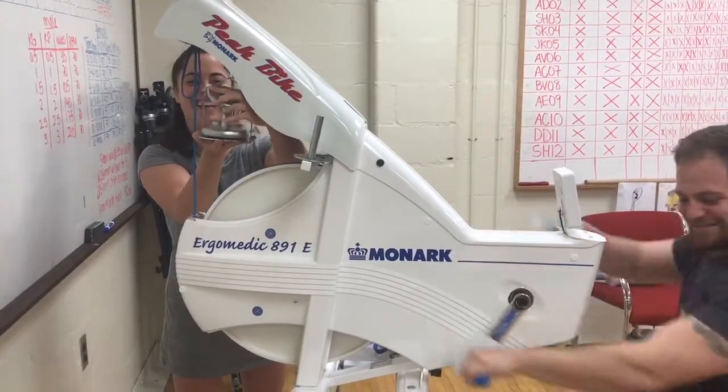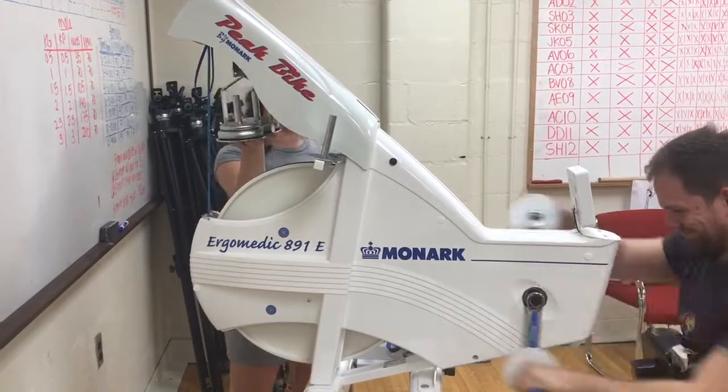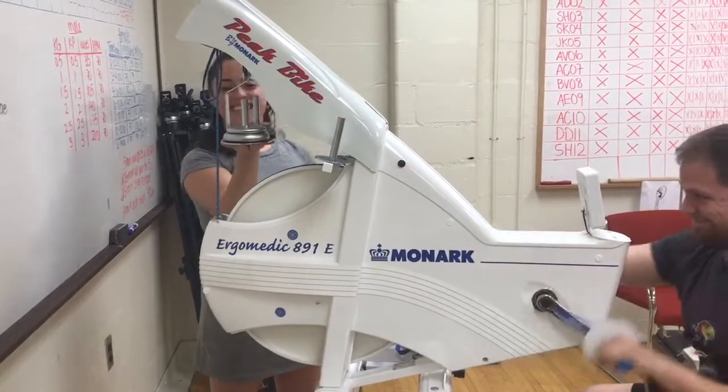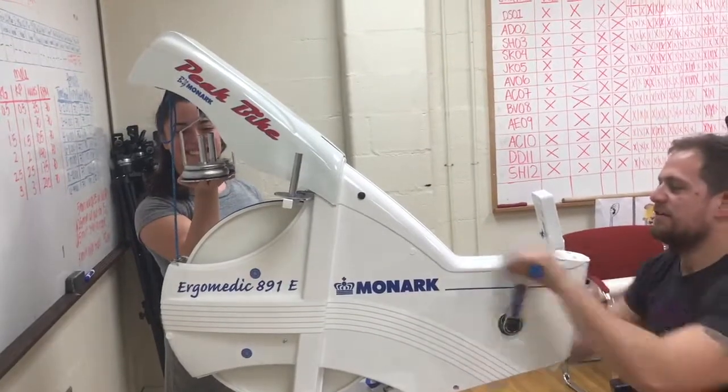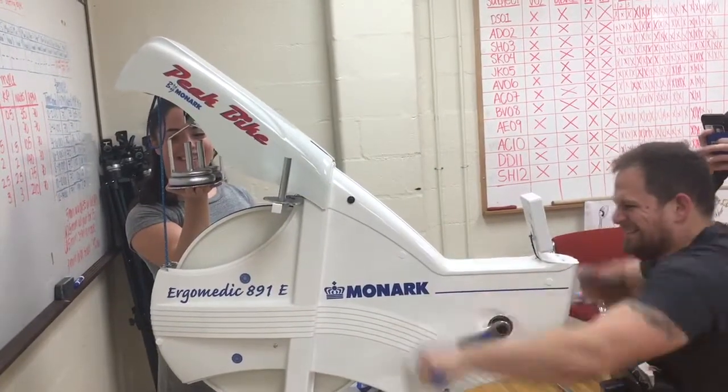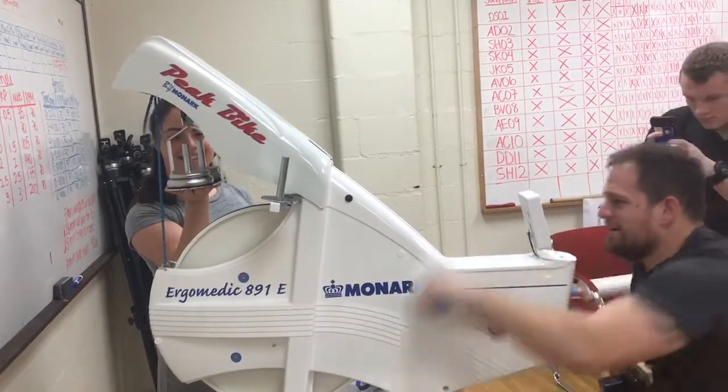In preparation for the 30-second Wingate trial, one researcher should count down from five. At three, the subject should begin to pedal with max effort, so by the time the weight is added, they are already pedaling with full power. The Monarch displays power in watts on the screen every two seconds.